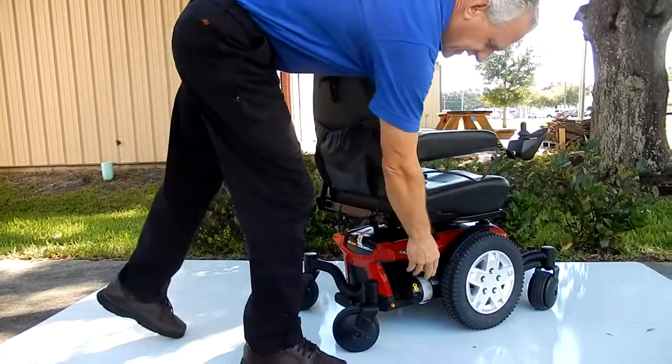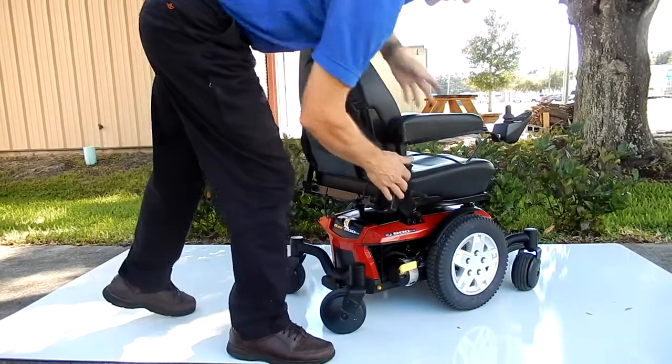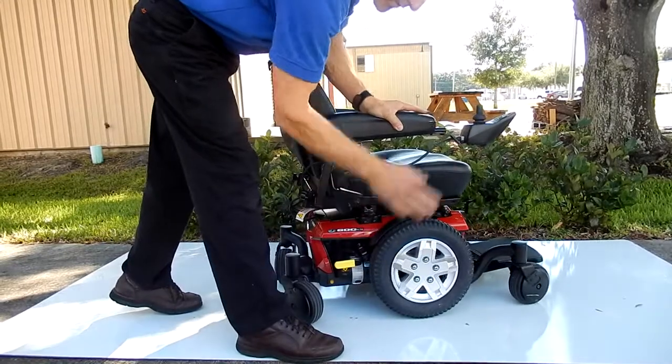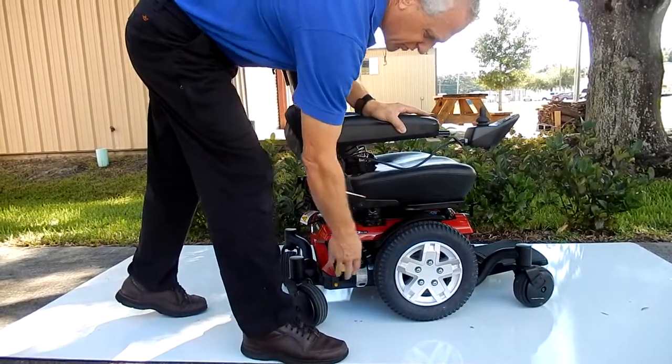This chair can be put in neutral. There's a lever here — if you put the neutral down, the wheel becomes freewheeling. You can do it on both sides, and that's how you can push your chair around.